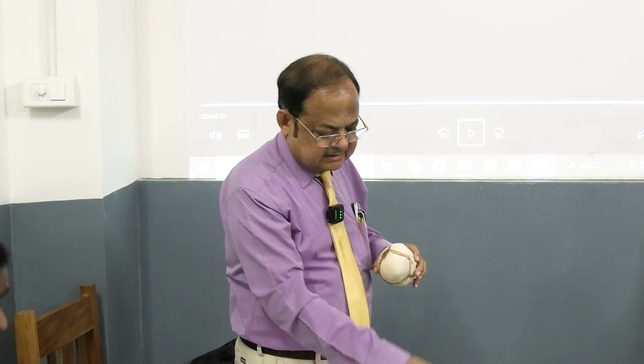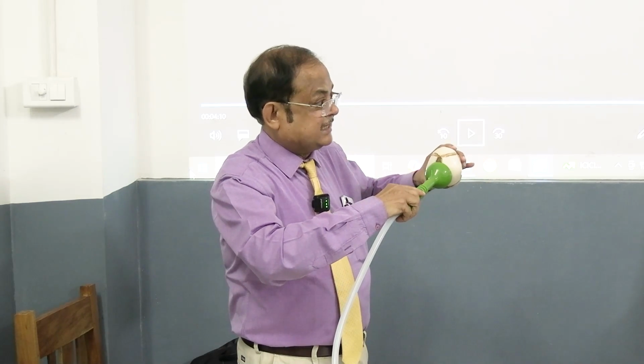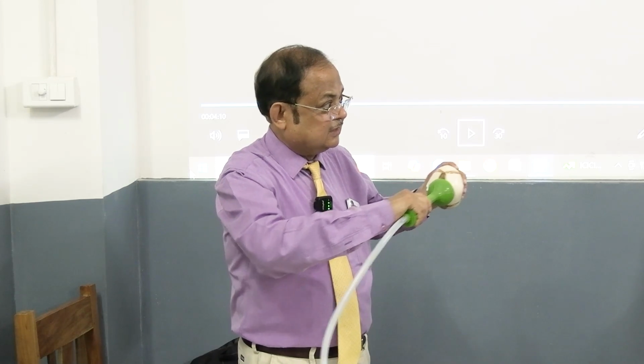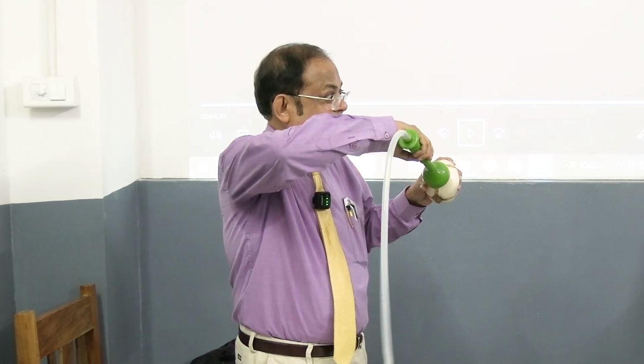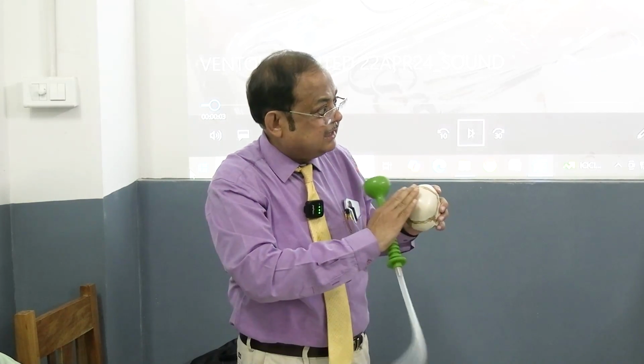And you are asking what is perpendicular. When you give the traction, you always make it perpendicular, that is, the cup and the handle. Otherwise, if you do not, there will be detachment. So always make it perpendicular. It is the perpendicular of the handle with the cup. The cup is already along the fetal head, that is the vertex presentation. So this is all about it.